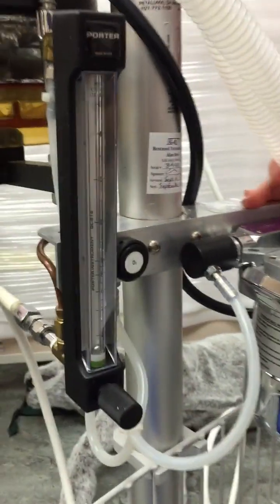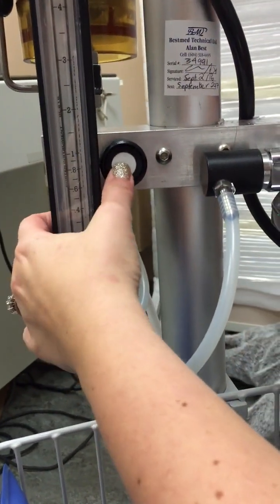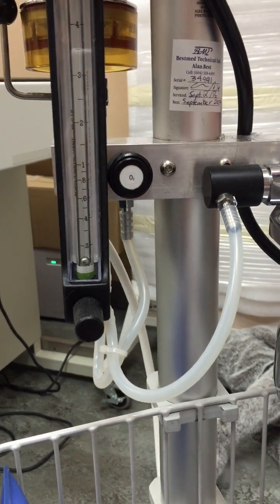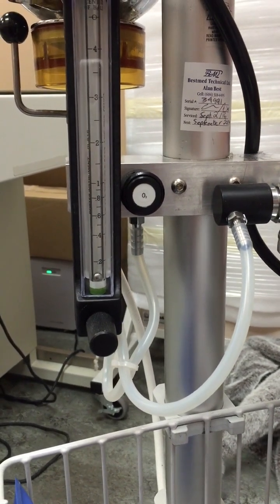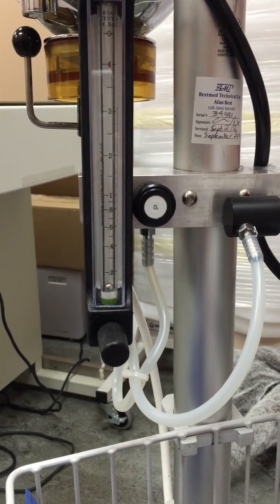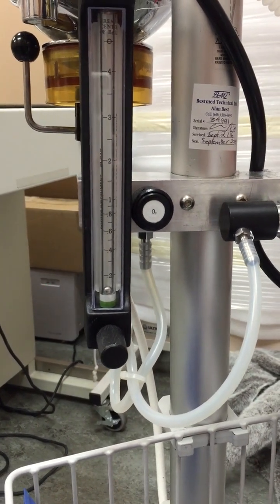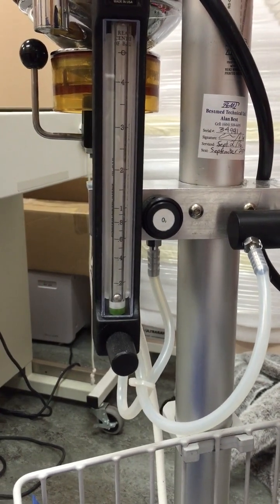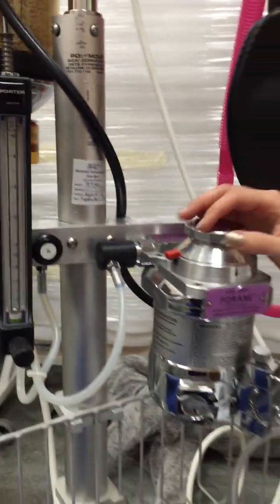Before we get to the flow meter, I'd like to point out the oxygen flush valve. Please note that when you push that button, the oxygen flows in at a rate of 75 liters per minute. It is very fast. Because of this, you are not to be using it on a live patient. To do this could potentially kill your patient. What you will use it for is for leak testing and potential anesthetic emergencies.